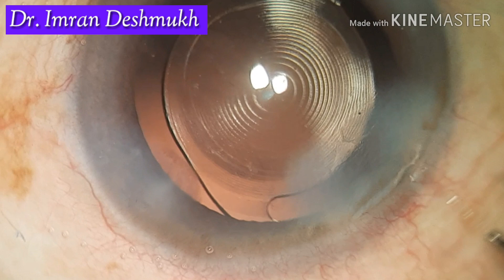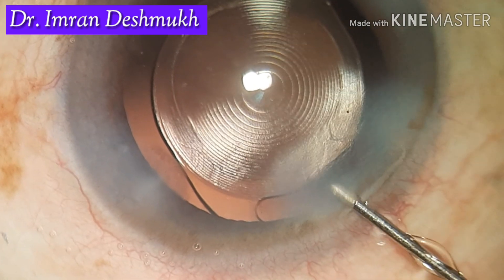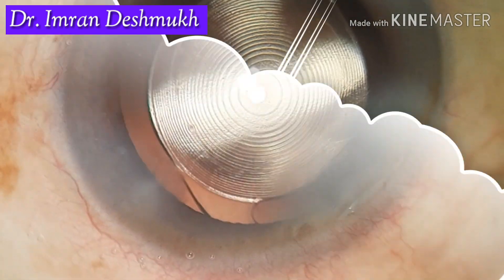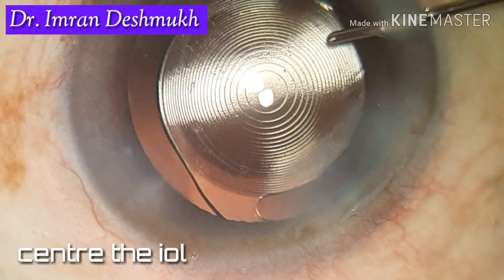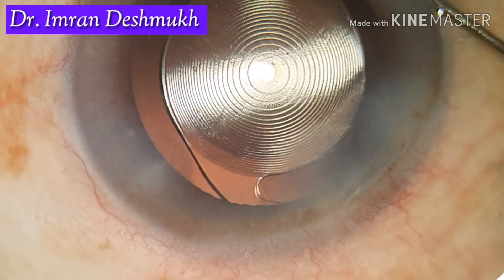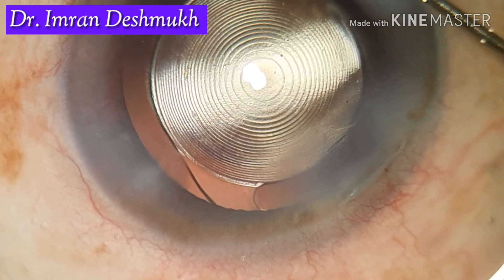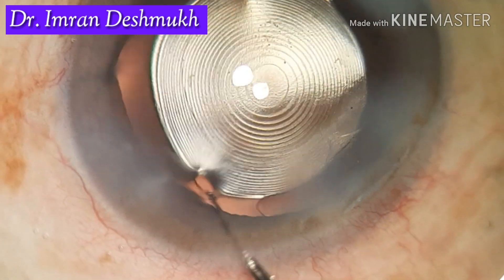Don't go too far inside — hydrate the outer one-third of the main wound, essentially the outer lip. Don't use a lot of force; use lower pressure, as excessive force can cause Descemet's membrane detachments and other complications. Once hydrated, you can go inside, center the IOL, and optionally use intracameral moxifloxacin. After centering the IOL, you can hydrate the side ports again. I hope this video was helpful — thank you very much.